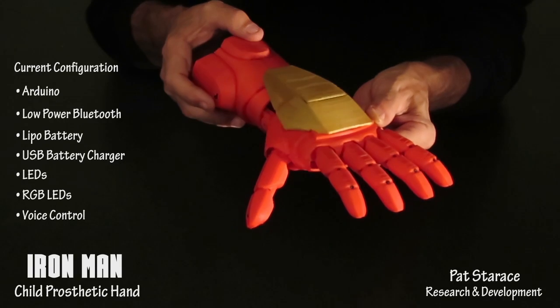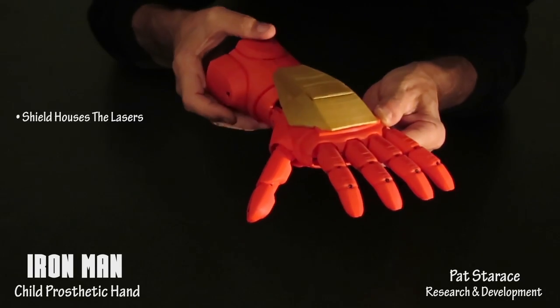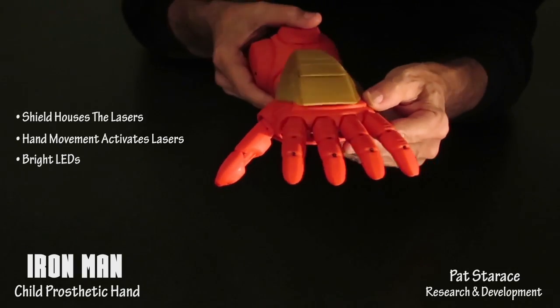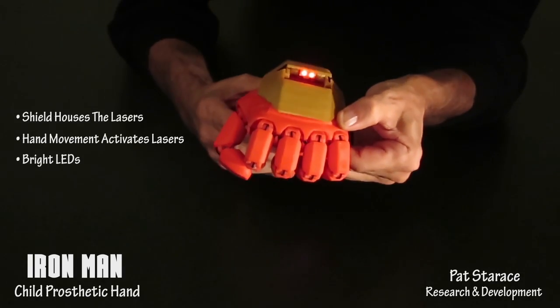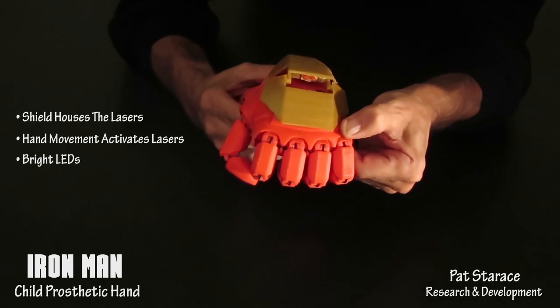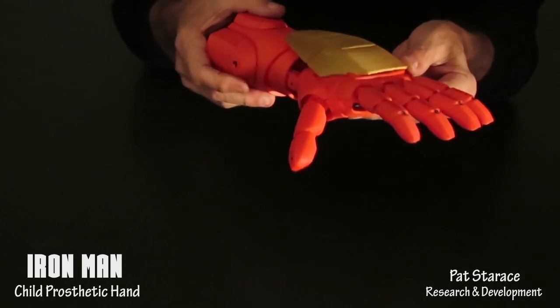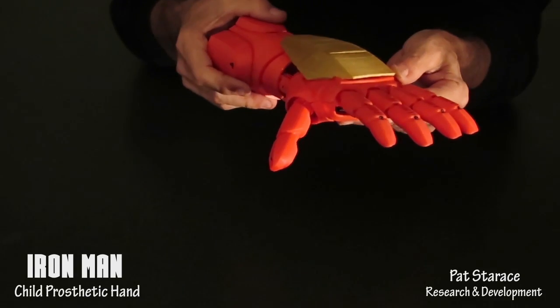It can even be voice controlled, as you'll see in a future video. The shield houses the lasers and is activated when the hand is bent down. Fire lasers. Lasers off. Of course we could have put in real lasers, but this is for kids.